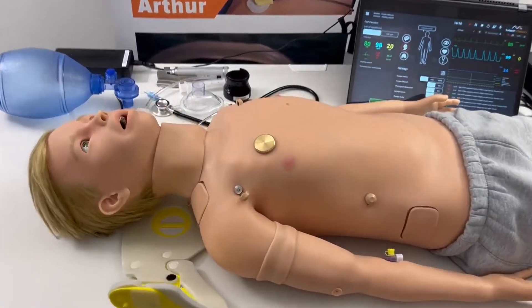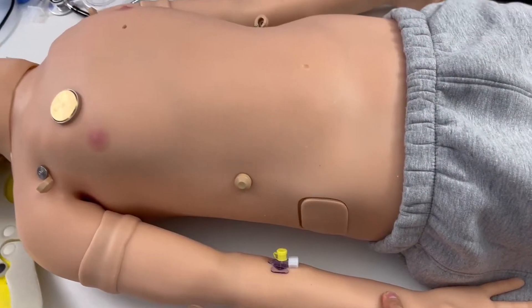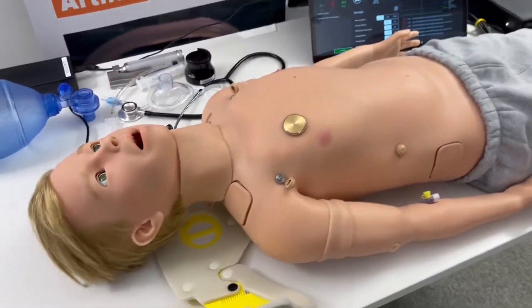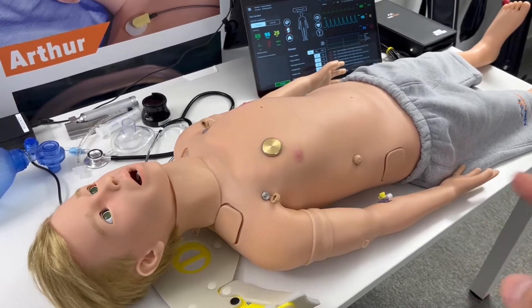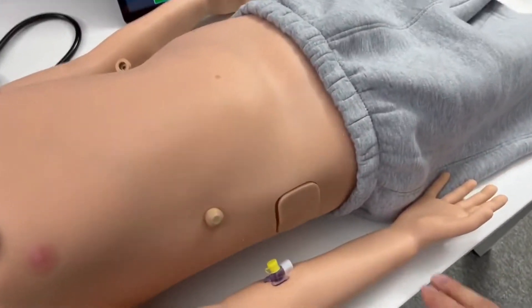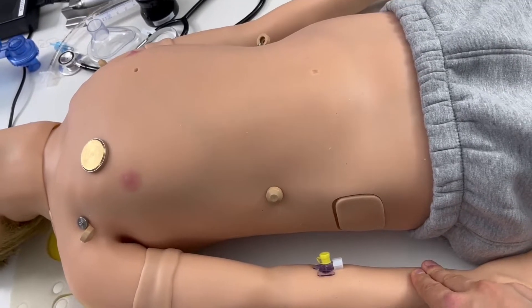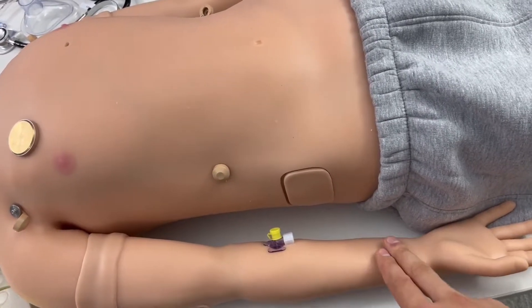What's also new with this version of Arthur is the technology used for pulses. At all pulse points, the pneumatic technology has been replaced with magnetic technology. It's impossible to show in a video, but it feels more realistic, it is reliable, and it's easier to connect and disconnect the limbs. They trigger instantly when you touch them and feel nice and physical under your fingertips — you can actually feel them tapping under your fingers.